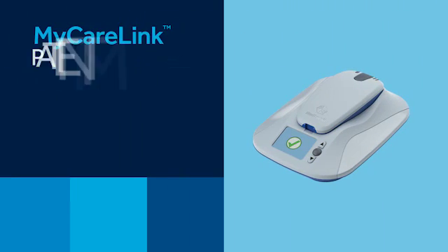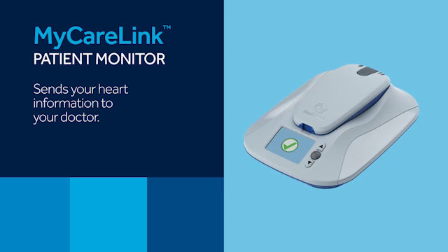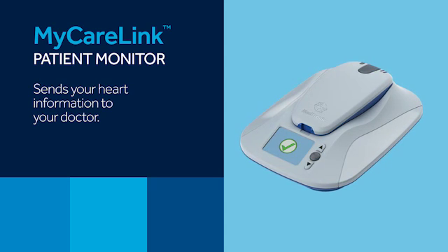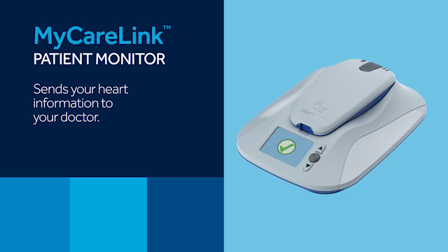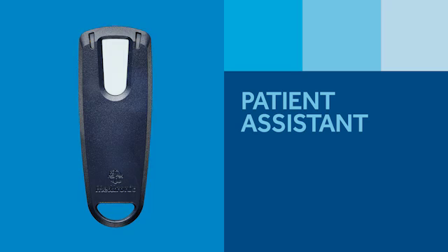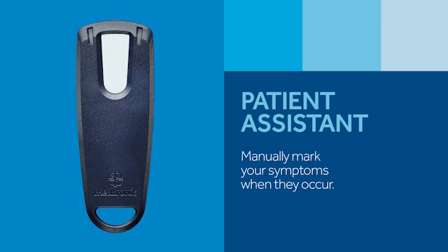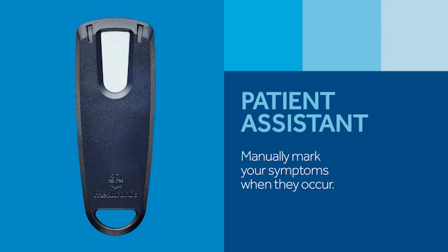And the MyCareLink Patient Monitor, which is a bedside unit that collects data from the Reveal Link ICM and sends it to a secure location where your doctor can view it. The patient assistant is an optional component — your doctor will decide if you should get one. It's used to mark specific heart rhythm data in the Reveal Link ICM when you feel symptoms.